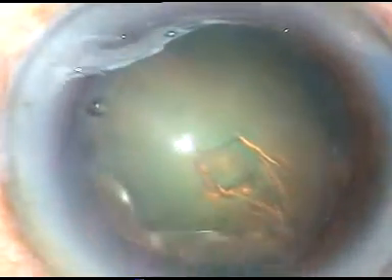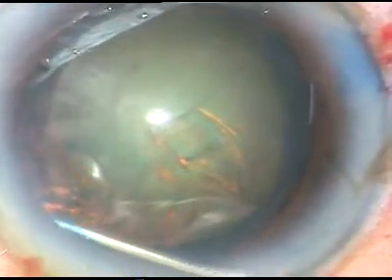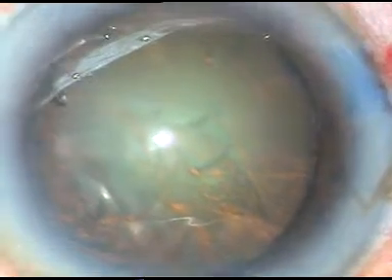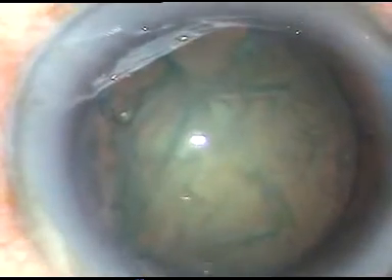Now see hydrodissection. The fluid wave is passed and it goes to the other side. Tap the opposite equator at 7 o'clock — you can see the fluid wave coming anteriorly. This means the cortex and the nucleus — the capsule and the nucleus — have been separated. The nucleus rotates very nicely.